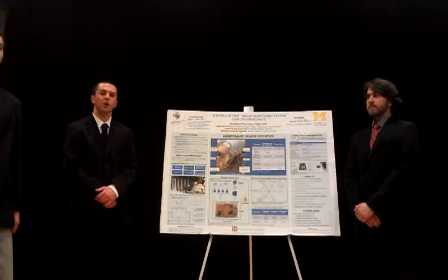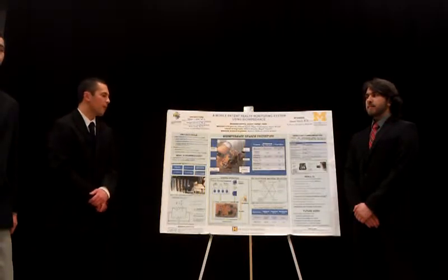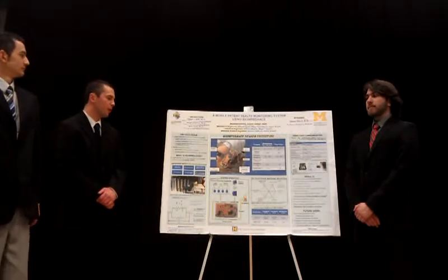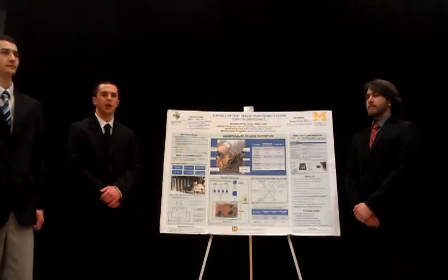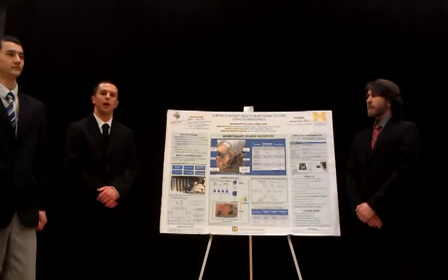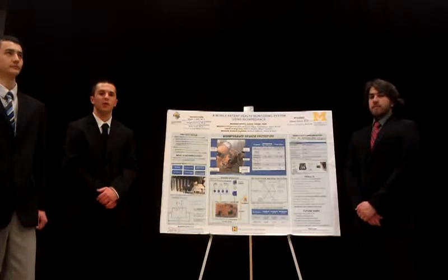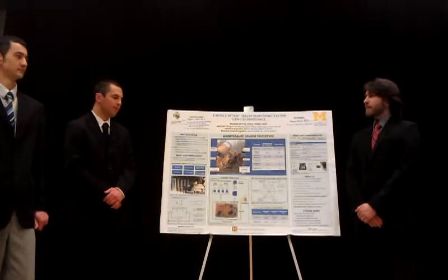To do that, we inject a current into the body at a frequency of 10 to 100 kilohertz and wirelessly transmit the signal to a receiving computer. The benefit of a mobile solution over a stationary system is that patients will be able to be discharged from the hospital sooner, and physicians will be able to monitor their health remotely from a home setting.